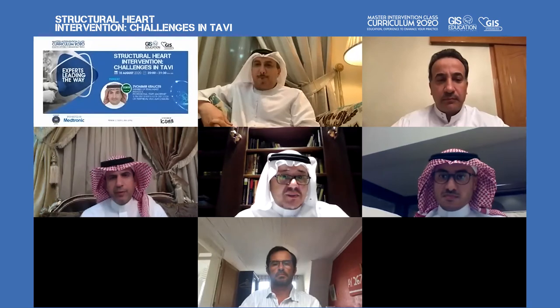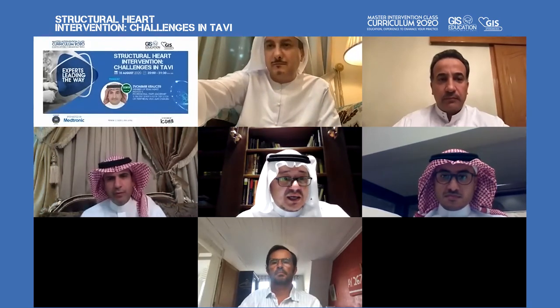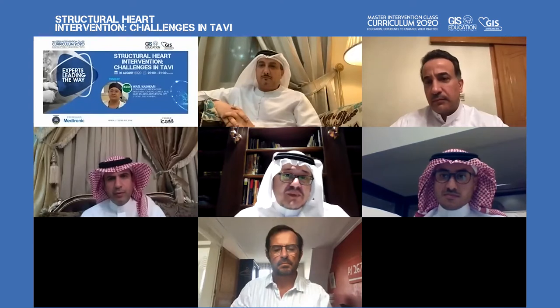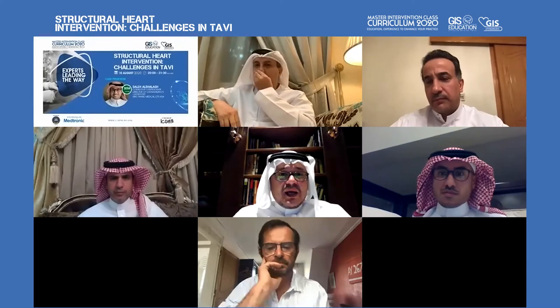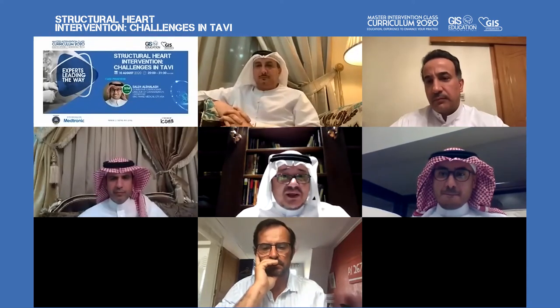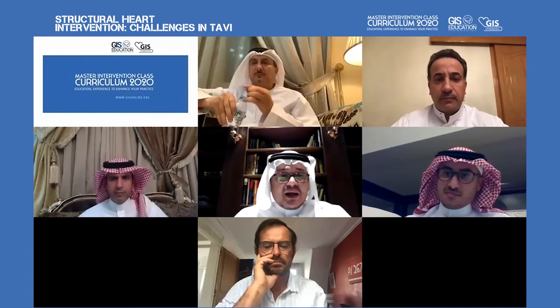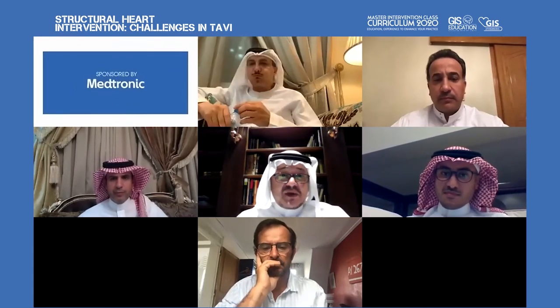Well, thank you very much, Dr. Labon. It's an excellent talk. I have just a couple of comments for the TAVI. Whenever you plan to do a case and you start, your catecholamine goes high, and most of the focus goes around the access. Whenever you do carotid or subclavian, or any other access that is not femoral, you have to focus on the access, yes, but it's very important.